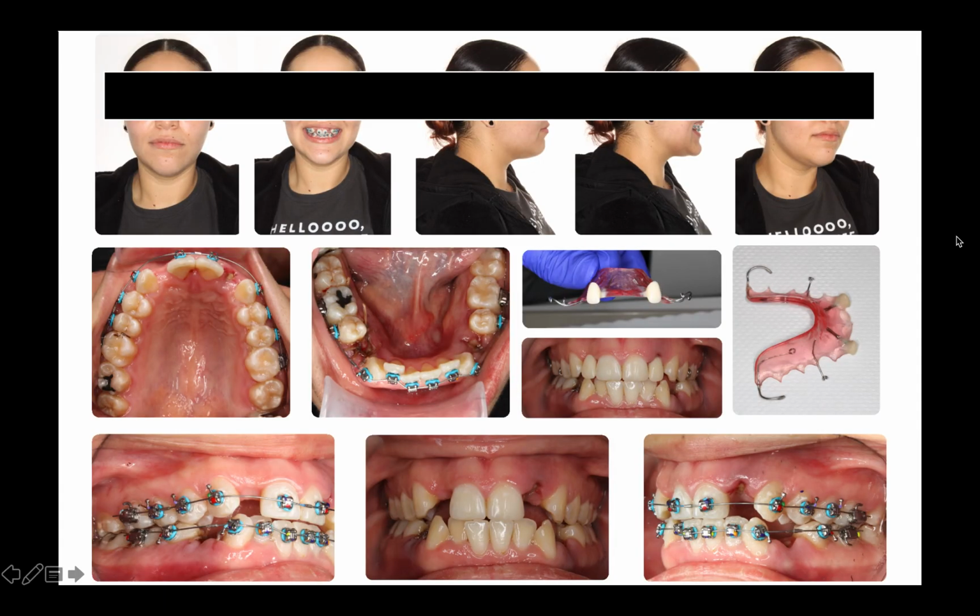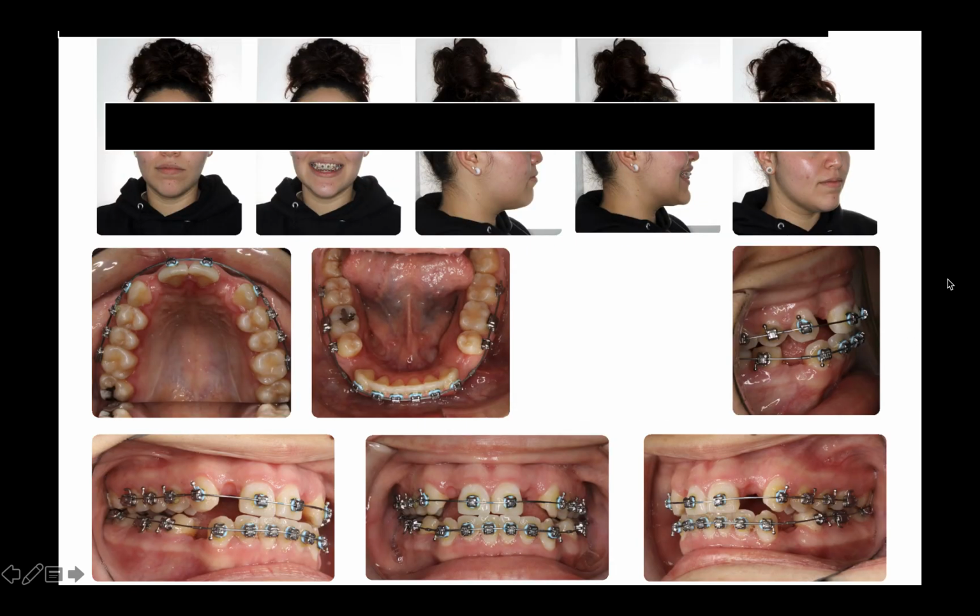Here, this is at her banding for her braces in the graduate ortho clinic. Again, compliments to Dr. Naeem. Here you see this is the stay plate that they delivered. And here you see the braces on, and this is the patient in them. And again, you'll see the next picture of her actually wearing the stay plate under that. So this is the first appointment.